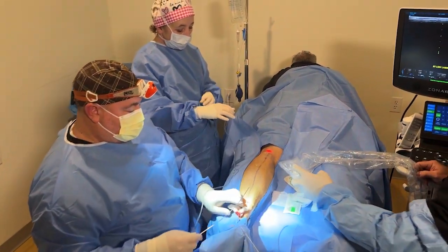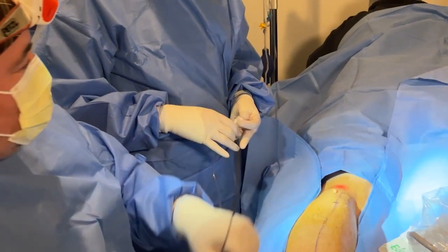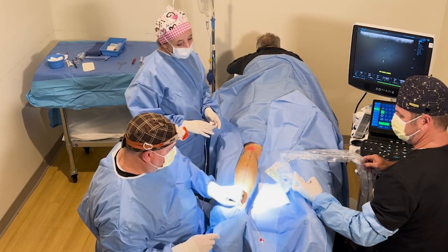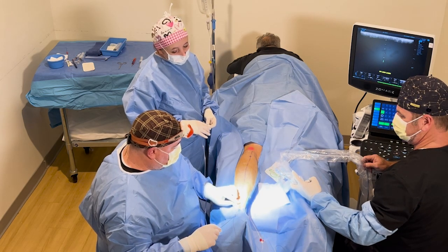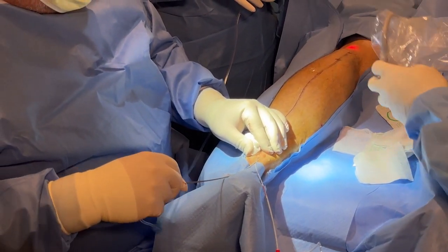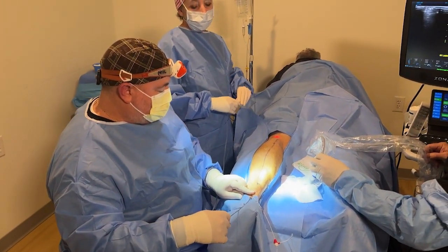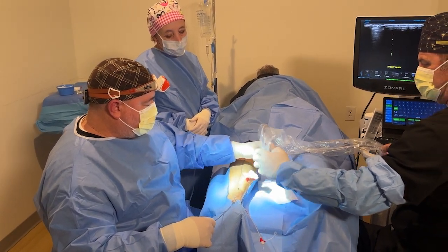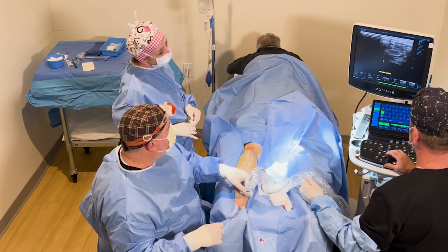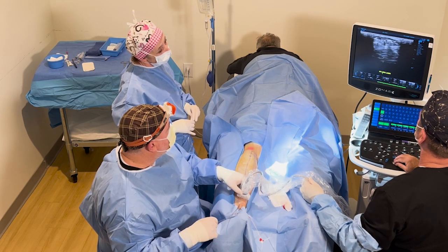Now we have this little metal wand with little holes at the end. This is attached to an IV bag on a pressure bag that has lidocaine and saline — that's going to be our tumescent, our numbing medicine. We go right in through that little hole. Every time I say 'on,' Tammy turns on the machine so that medicine runs under the skin. If we look up here, you see the little white dot in that vein, and now you see all that black — that's all the numbing medicine, that's the tumescent anesthesia.